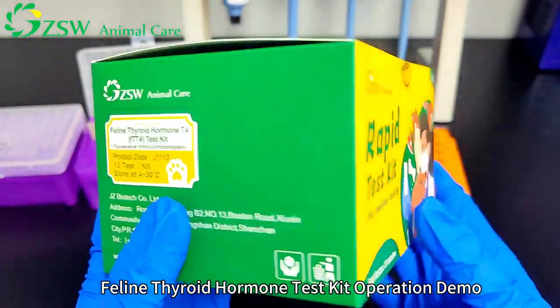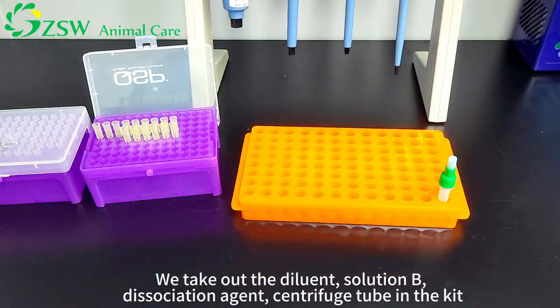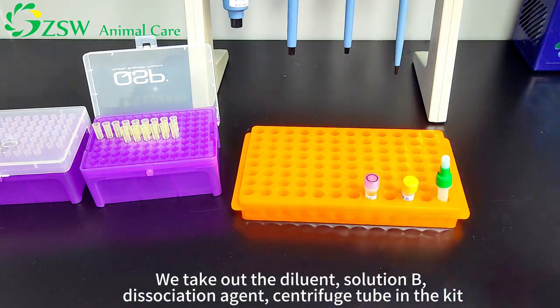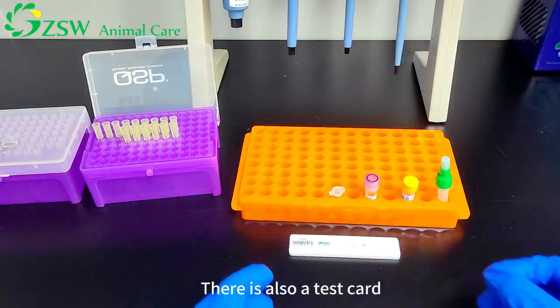Feline thyroid hormone test kit operation demo. We take out the diluent solution B, dissociation agent, and centrifuge tube from the kit. There is also a test card.